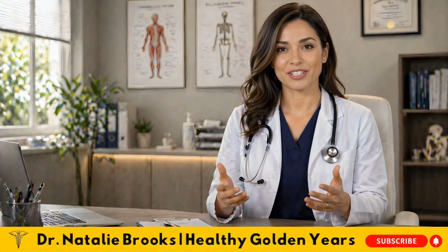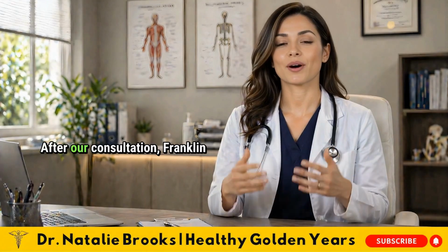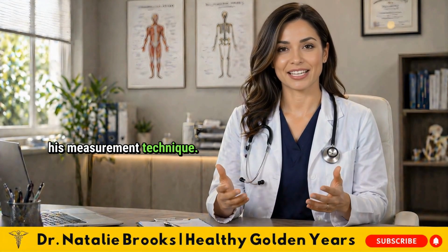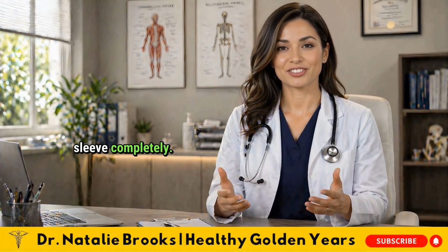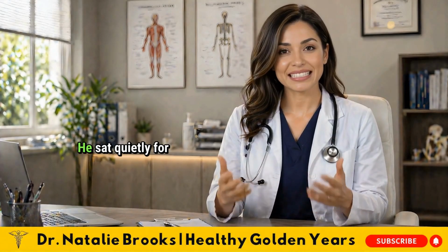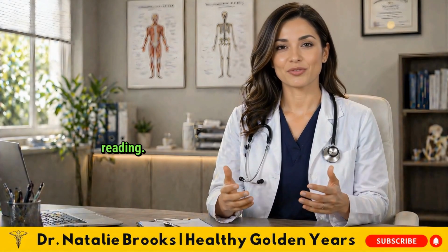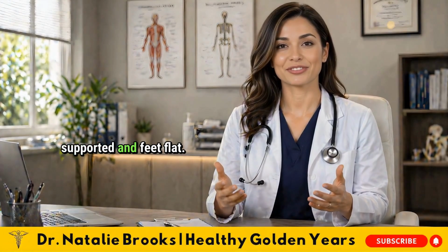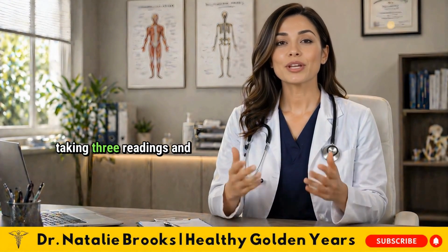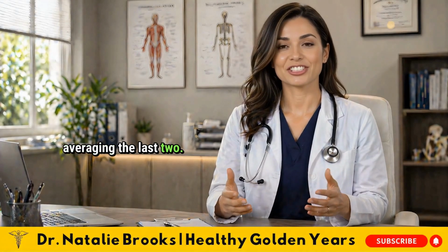I promised I would come back to Franklin. After our consultation, Franklin corrected all 6 mistakes I had identified in his measurement technique. He rolled up his sleeve completely. He rested his arm on the table at heart level. He sat quietly for 5 minutes before every reading. He kept his back supported and feet flat. He stopped talking during measurements, and he started taking 3 readings and averaging the last 2.